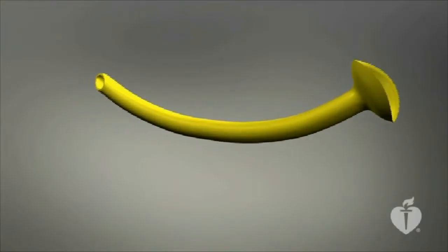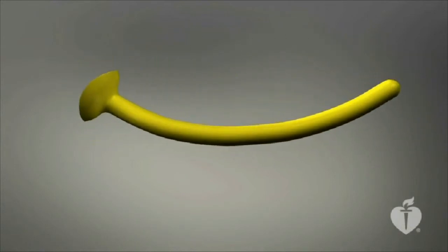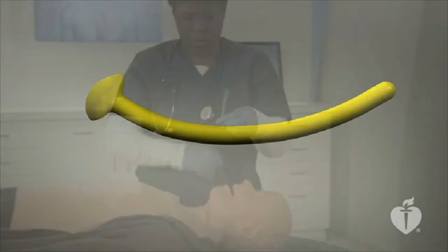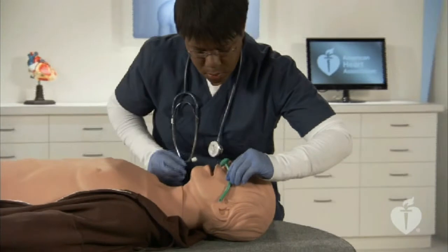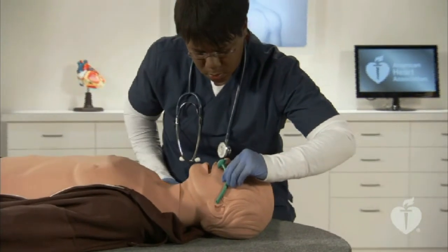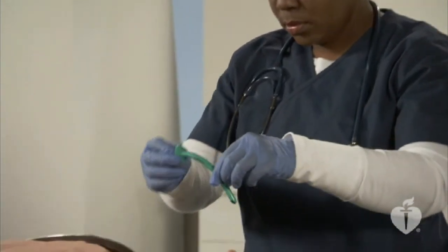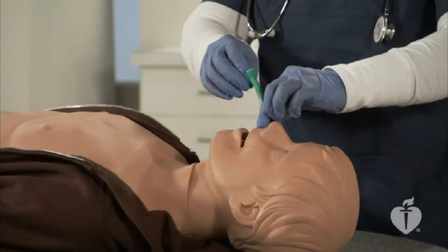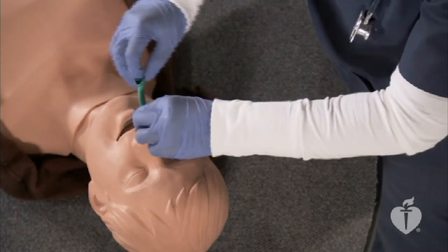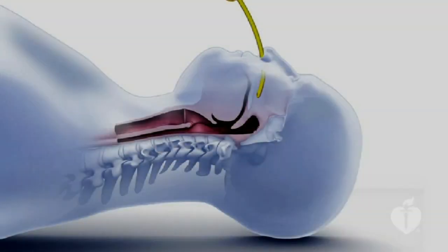The nasopharyngeal airway, or NPA, is a soft, curved hollow tube that can be inserted through the nostril to facilitate ventilation. To choose the correct size NPA, place the flange of the device at the nostril, and the tip should just reach to the tragus of the ear. To insert an NPA, point the tip of the device away from the maxillary bone. Using moderate pressure and a gentle spiral motion, push the device into the nostril. When inserted correctly, the NPA should reach beyond the nasal cavity to the pharynx, providing a clear path for ventilations.